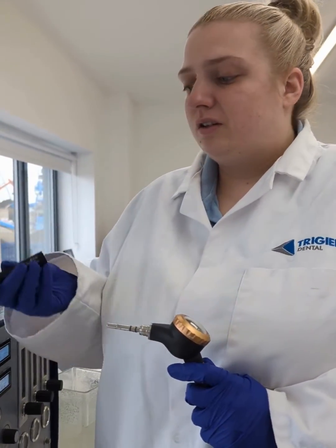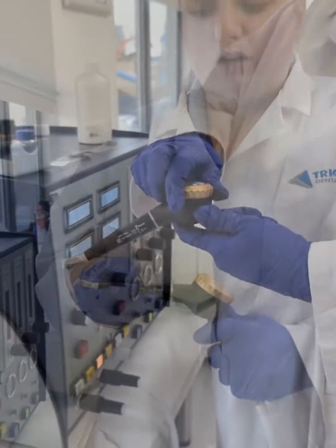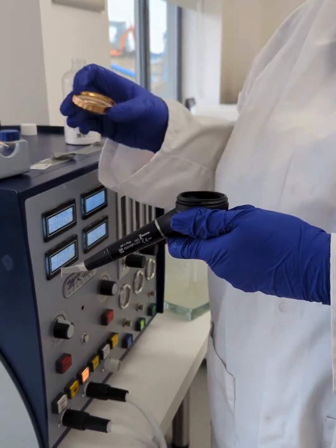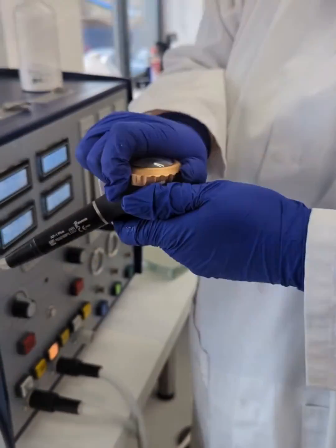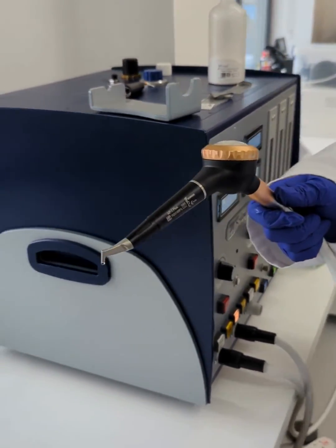I'm going to show you how to use the prophy handpiece. So you put the prophy nozzle on to fill the ball with some prophy powder. Screw that ball back on and now it's ready to use.